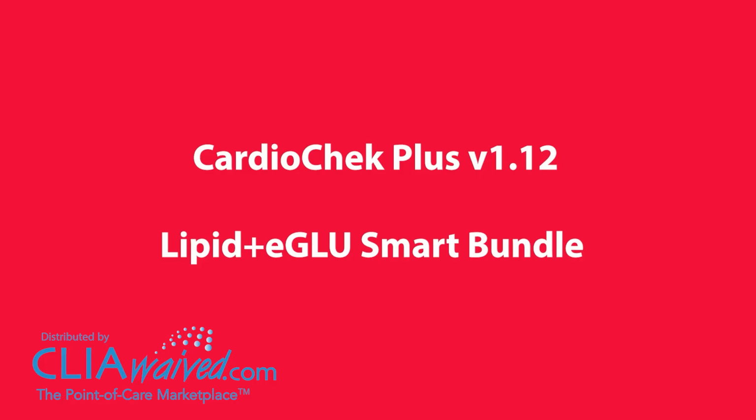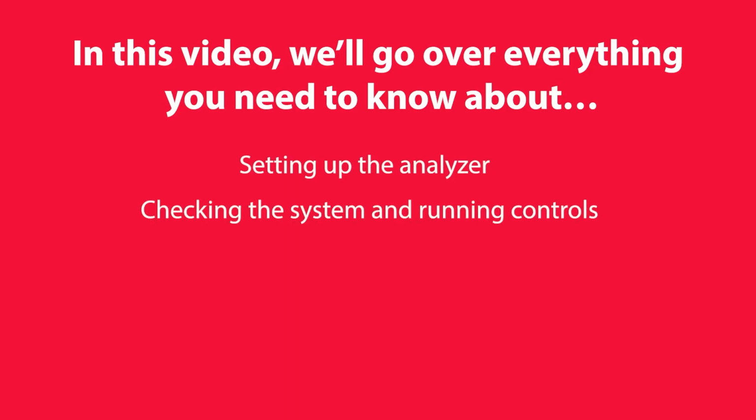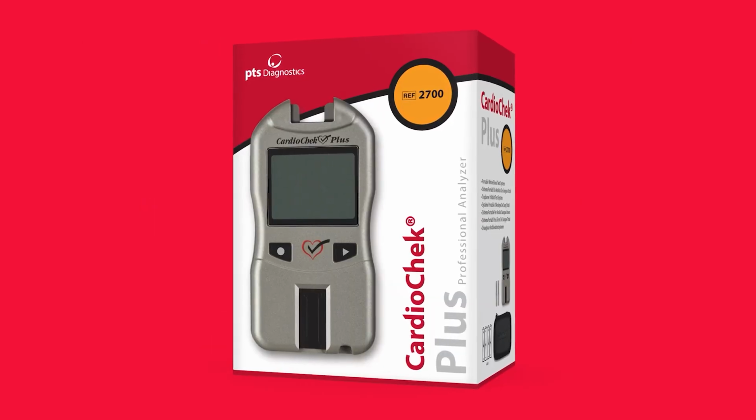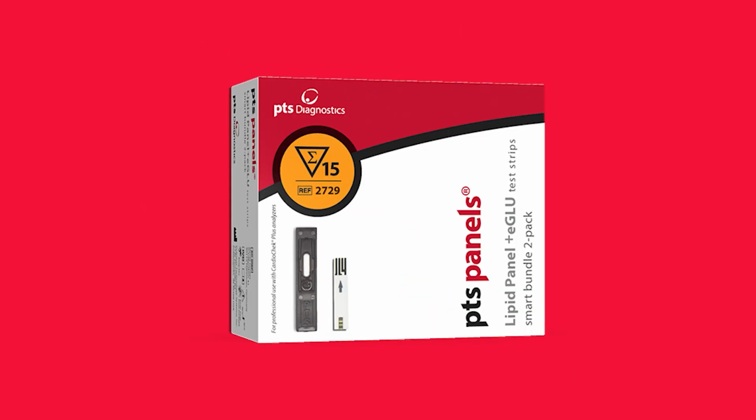In this video, we'll go over everything you need to know about setting up the analyzer, checking the system and running controls, running a test, cleaning and disinfecting the analyzer, and storing and handling the analyzer. Today, we will be showing you how to run a PTS Panels Lipid Panel plus eGlu Smart Bundle test.